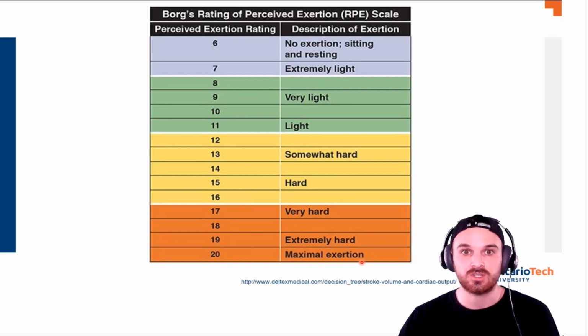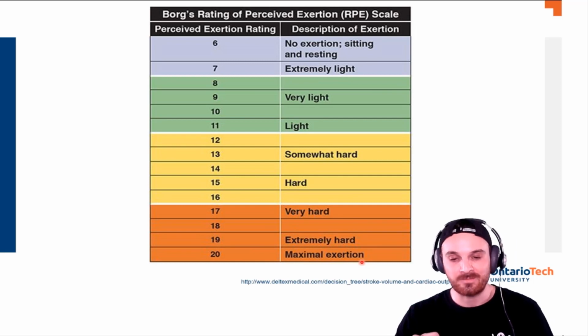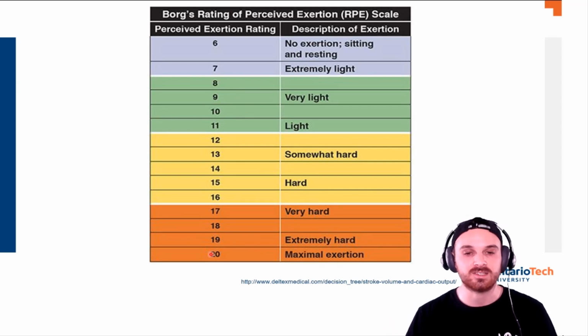Another thing you'll see, especially in this test, because I didn't do it quite right, is that the maximal exertion does not always directly line up with heart rate, especially in things where the person is not practiced and are very muscularly demanding, particularly cycling, if the person is not practiced at cycling.